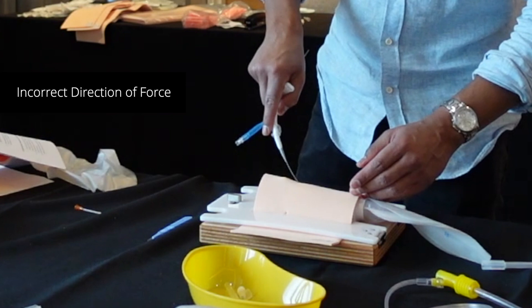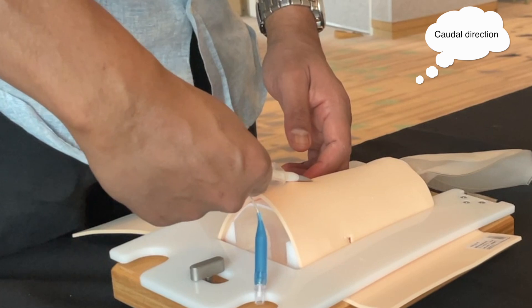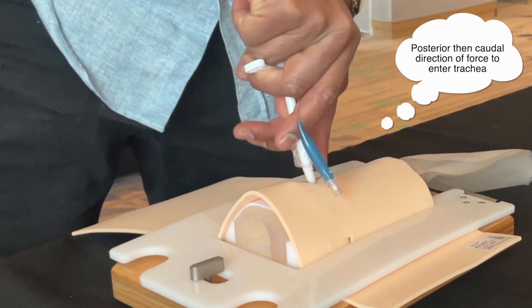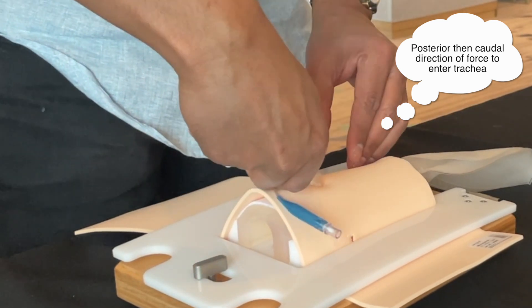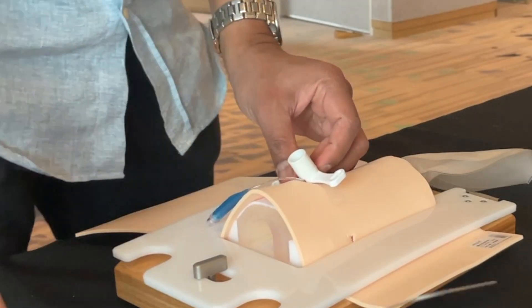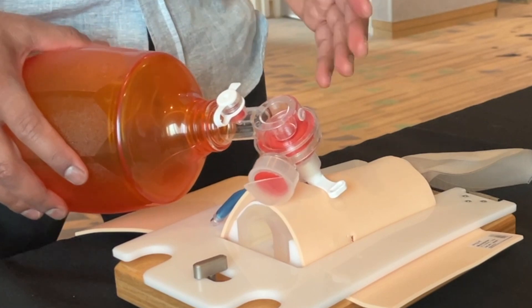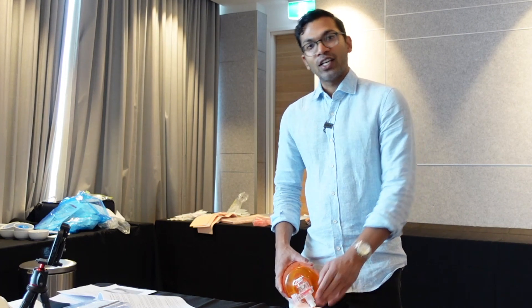Another issue is incorrect force application. If your force is applied only in a downward direction, it may not get through the hole. The correct motion is initially downwards into the trachea, then inferiorly with a rotating motion — that's more likely to get into the trachea and allow proper ventilation. After inserting the Melker, confirm placement by checking end-tidal CO2 if possible, along with rising oxygen saturations and good chest rise and fall.